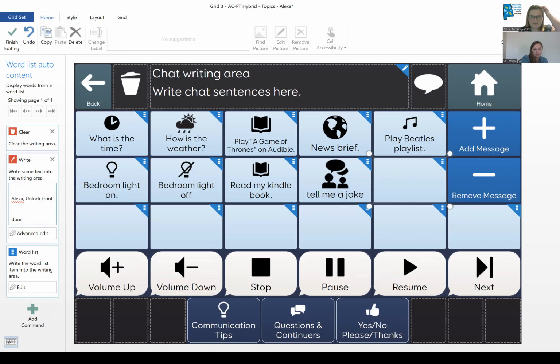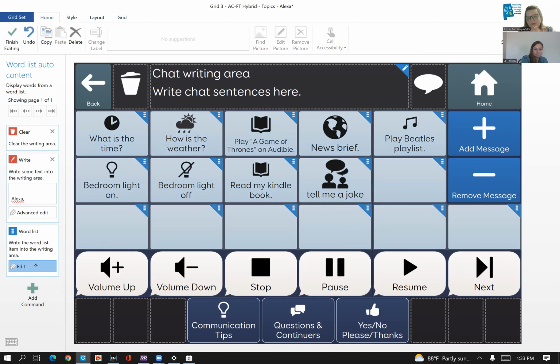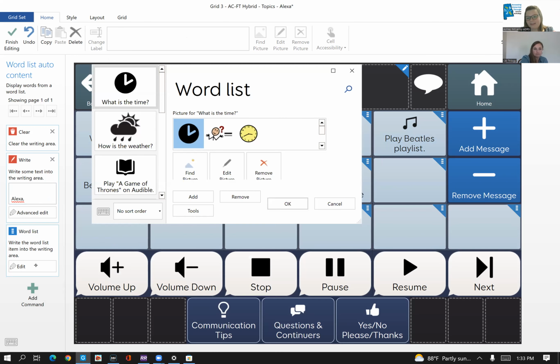While you're doing that, another thing I want to clarify is that Lane mentioned going into Grid 3, and I think I did too initially, but we didn't explain what Grid 3 is. Lane, that's the communication software that is installed on the Control Bionics devices. That's correct. Yes.